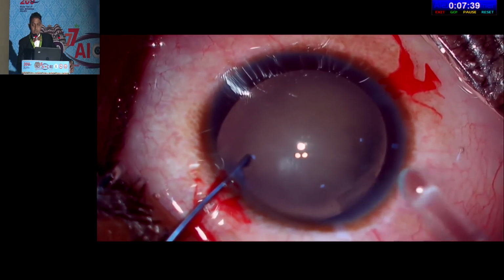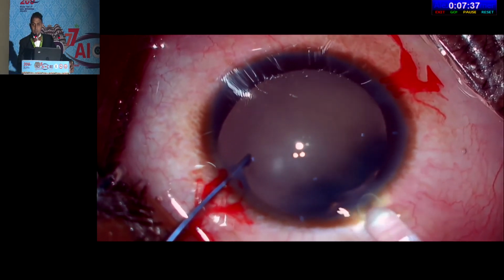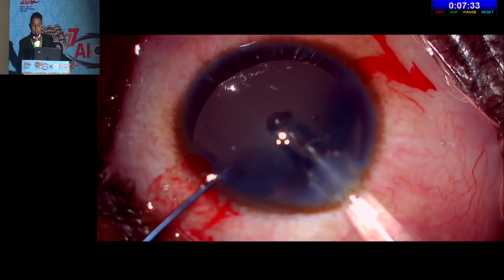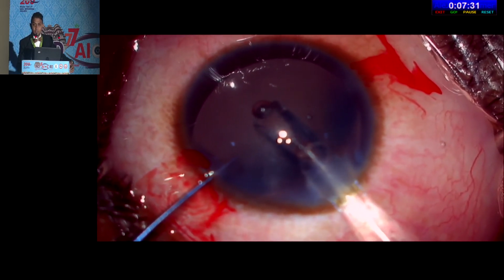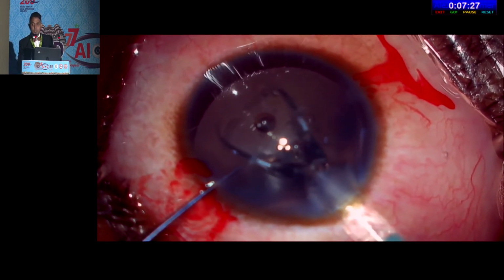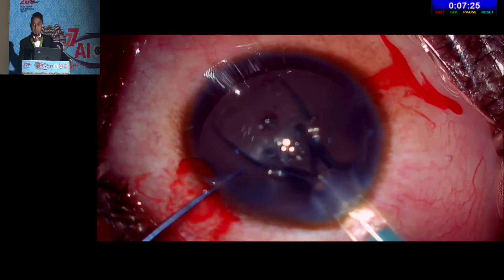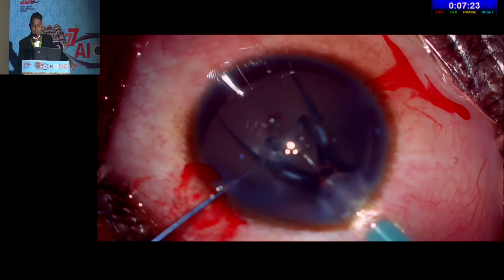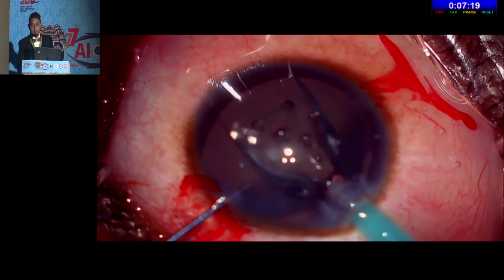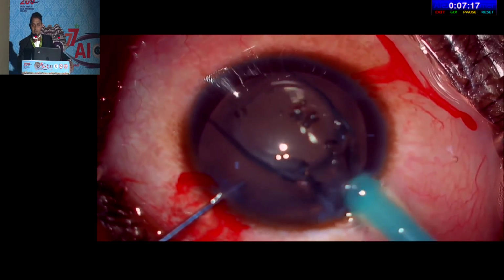While injecting, I have two important tips. Don't directly push the lens completely inside. After you inject half the lens, wait for the leading flaps to open up, like the wings of a butterfly. Once it opens up, you know that the possibility of the lens twisting, turning or flipping inside the eye is almost nil. Once that opens, I inject the remaining half of the lens.